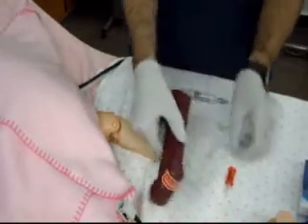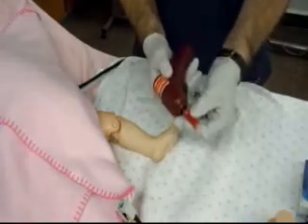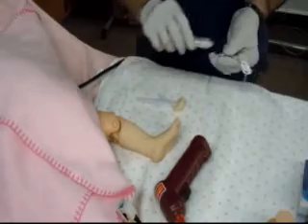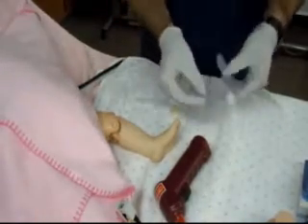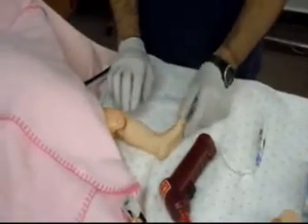Prior to insertion, we need to assemble our equipment. So we need to take our EZ-IO driver and attach the pediatric size needle. We then need to take our pre-filled syringe and flush our lock. Make sure that there is no air in the line. And now we're ready to determine the site that we're going to use.